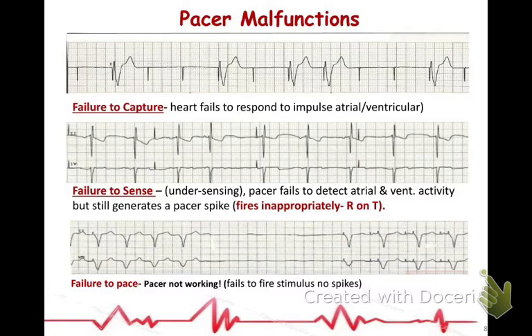Pacemakers malfunction. They can. So the first one is failure to capture. The heart fails to respond to the impulse.